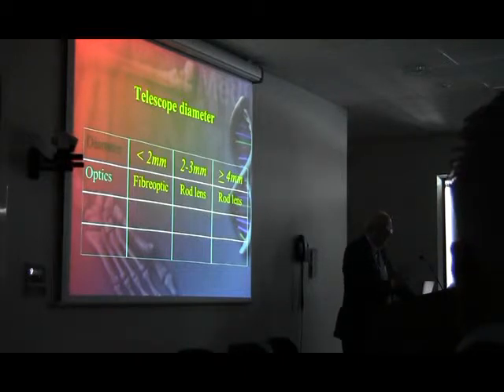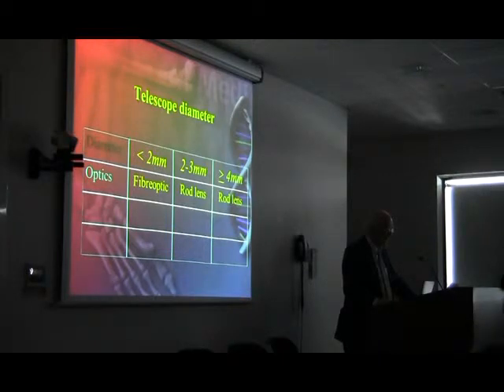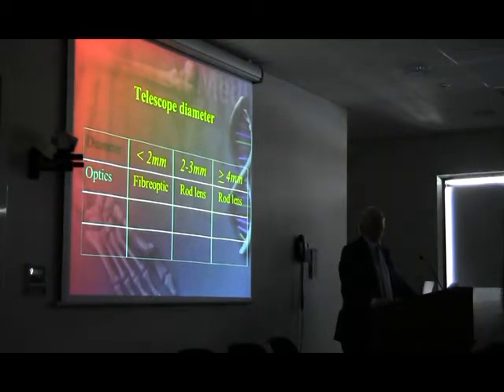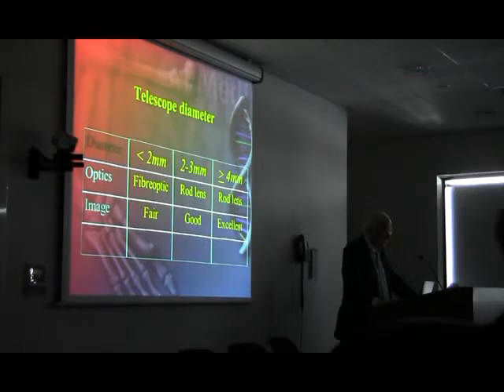And the telescope itself is crucial, the rod lens versus fiber optic systems. Again, I like to have a very good view, and that's one of the main reasons I don't like the fiber optic. I like the very clear view that you get from the rod lens. The fiber optic will give you the smaller diameter, but you're paying for it with the view and with the image size. And I know, Mark, you used to be always fiber optic flexible, and now you've moved over, haven't you? So no more fiber optic. Okay, so that's sorted.